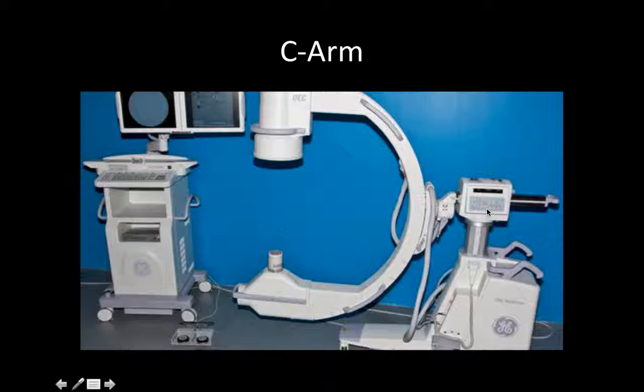And you have some adjustments on the C-arm. You have a horizontal adjustment, which is back here, called the wig-wag, so it goes side to side. You have an orbital adjustment, which is right here, like the rainbow adjustment, goes up and over and under. A vertical adjustment right here goes up and down. The two up and down buttons are right there.